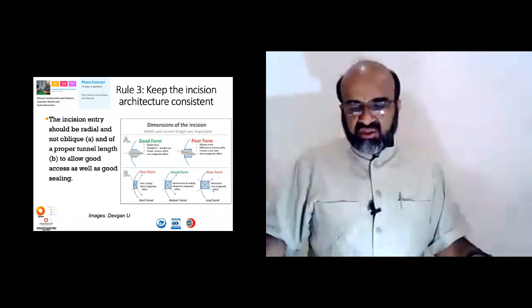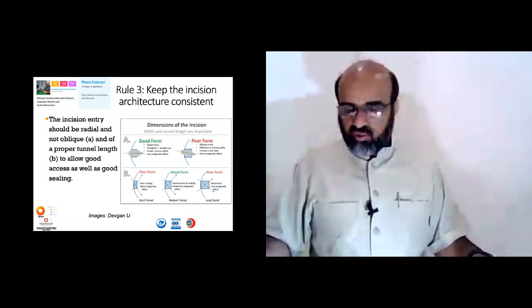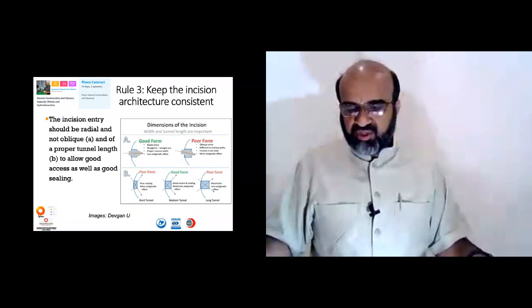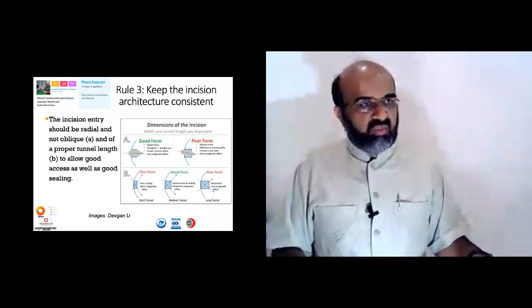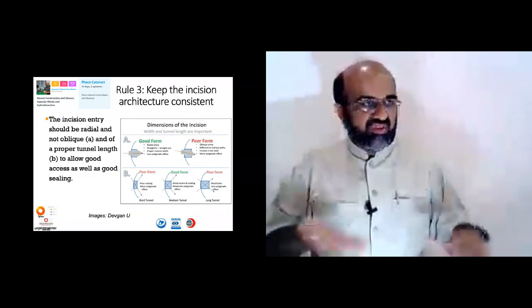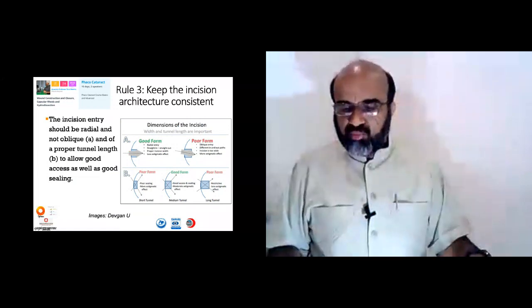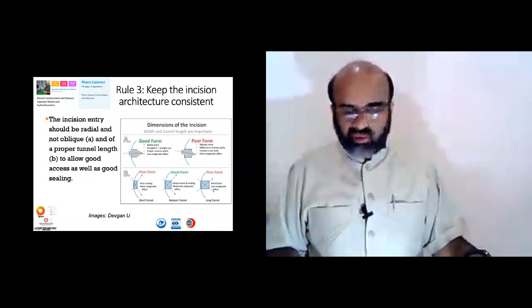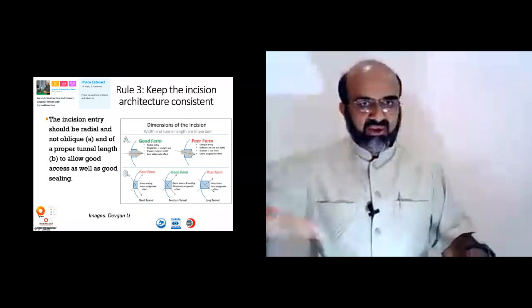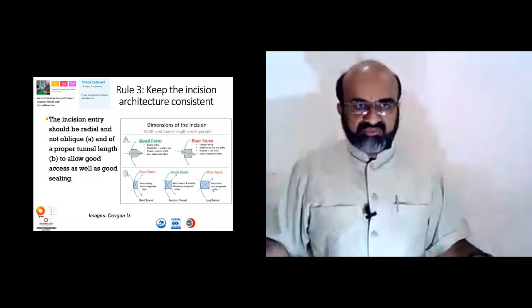That also gives rise to proper tunnel dissection and good healing postoperatively. You see in the diagram, this is a straight passage, the keratome is entering straight into the corneal stroma, and in poor form, here is the oblique passage, where the keratome is directed either rightways or leftways while entering into the cornea.